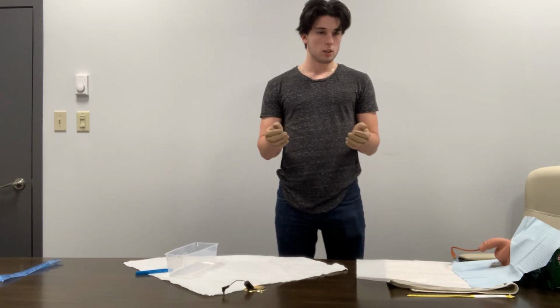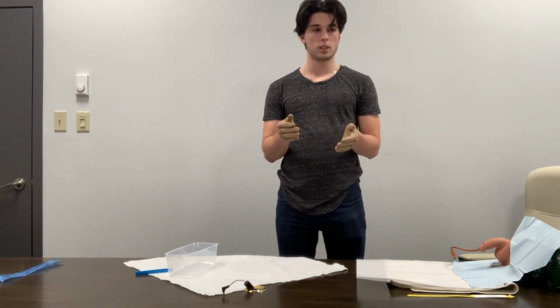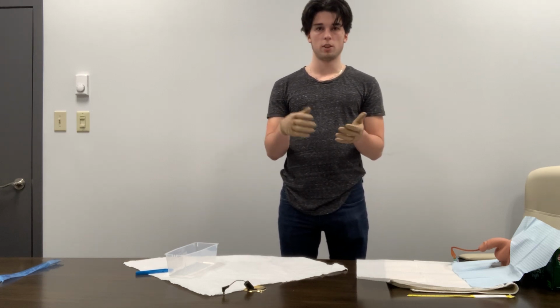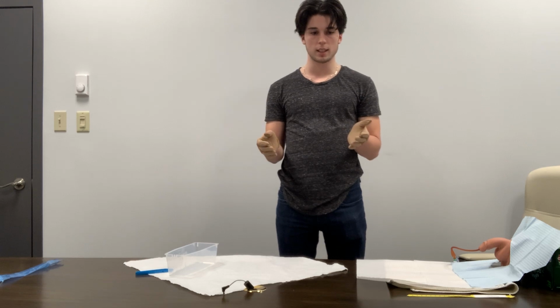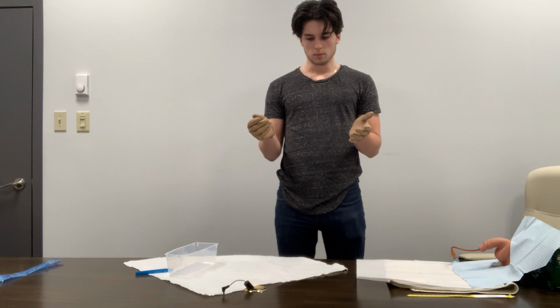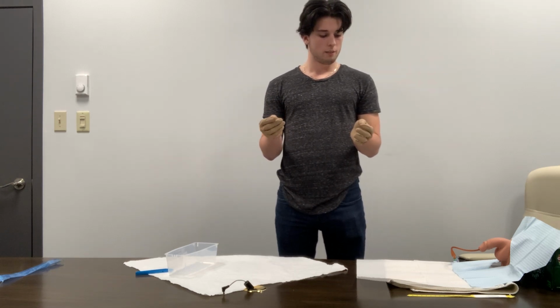So when I'm going to the chart to go document, I'm going to document that I inserted a 14 French Foley catheter to monitor, as the physician requested, to monitor the outputs. I inserted with sterile technique. I inserted 10 milliliters of sterile water to inflate the balloon. At the end, it was easy to insert. The patient tolerated it very well.